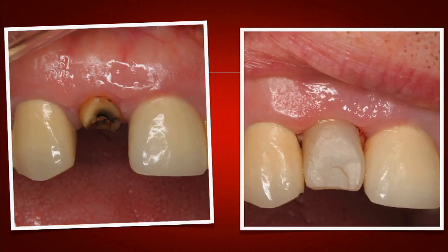If we take a closer look, you can see the condition of our tooth. We can see that we were able to atraumatically remove it and place our temporary. You can see the light occlusion mark that's there to denote that this tooth is not in occlusion whatsoever. And what we can start to see also is the beginning of the soft tissue development that is unbelievably, incredibly important when doing anterior implant restorations. By making a temporary, we're going to sculpt and maintain that tissue, maintain our papilla, so that when we go to make a final restoration, all of that is not a concern for us.